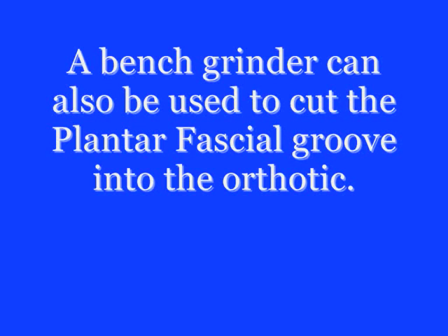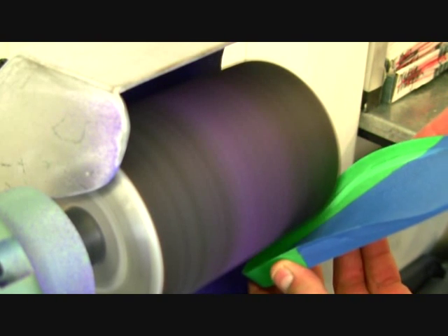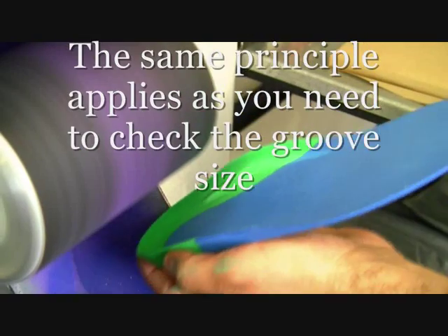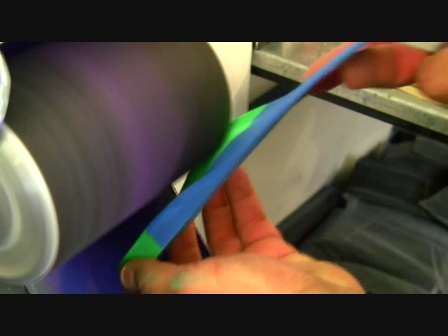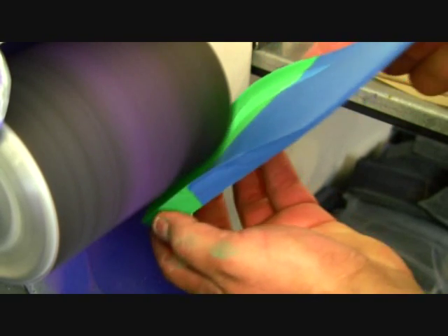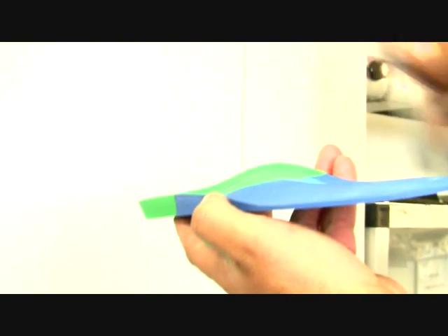A bench grinder can also be used to cut the plantar fascial groove into the orthotic. You can see the technician grinding the groove the same way as with the Dremel, but now using a bench grinder. All the principles remain the same: we need to check the depth of the groove and make sure that we take enough material out of the arch of the orthotic so that it is comfortable for the patient and gives relief.